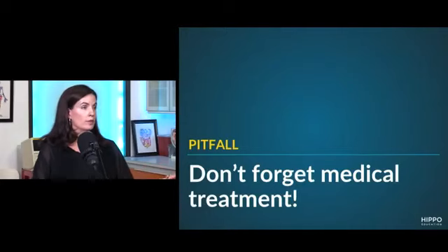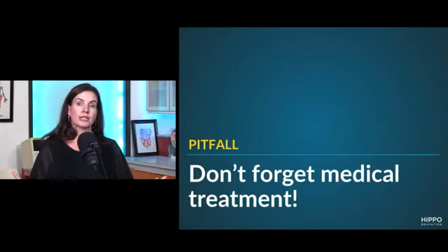Okay, is there a PEEP that's too high? You've maxed out your PEEP at this number. In the ICU, if I'm over 20, I'm worried. And in the emerge, if you're over 15, I think I'm worried. I would definitely be calling for backup at that stage because you'll start to get into real trouble with your hemodynamics. So 5 to 15 is the range that we're kind of allowed. Absolutely. And if you're going to 15, you want a well-resuscitated patient. The other thing to remember here is that you've got to treat their underlying disease.